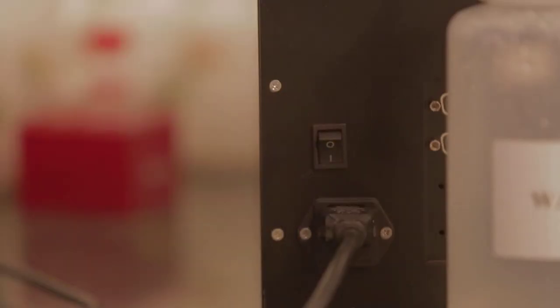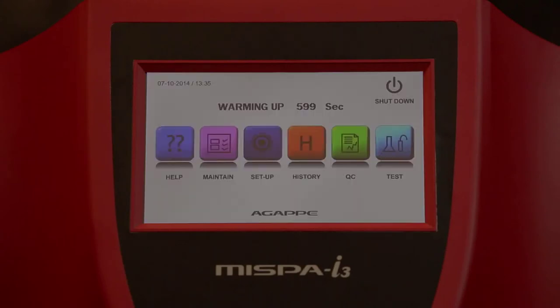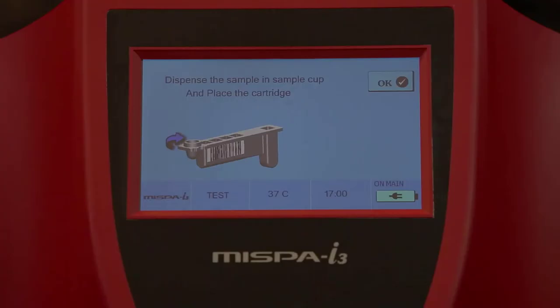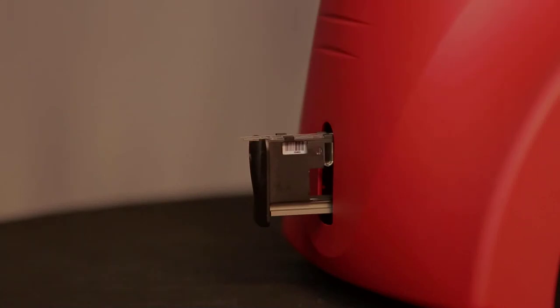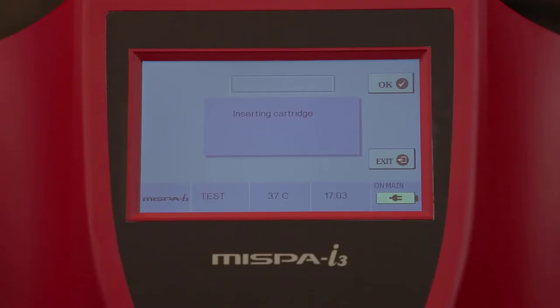Switch on the analyzer. The analyzer will enter into self-test operations along with temperature stabilization, ensuring the analyzer is properly working. To run the test, select the test function from the main screen. Insert the IC card for automatic calibration. Place the pre-filled cartridge for the specified test along with the sample in the carrier, which comes out from the analyzer, and select OK.